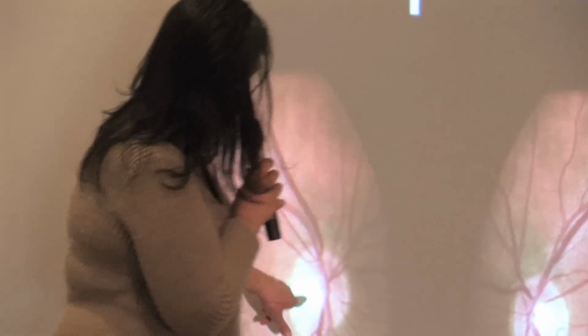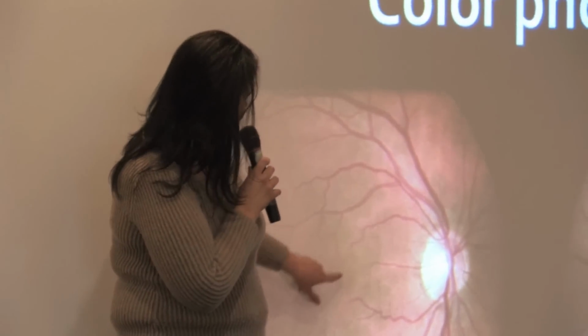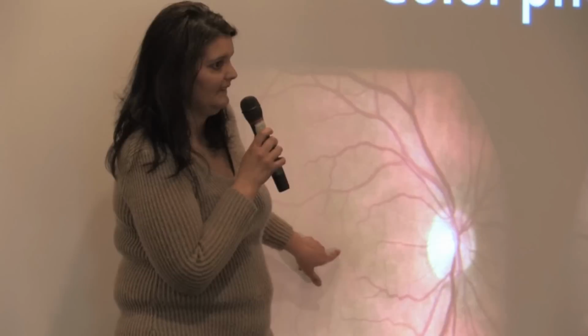We're just scanning this area, and that is only 3 millimeters, so it's not a big area. That's the optic nerve, the nerve that connects the eye to the brain, but this is the area that we're scanning when we do the OCT test.